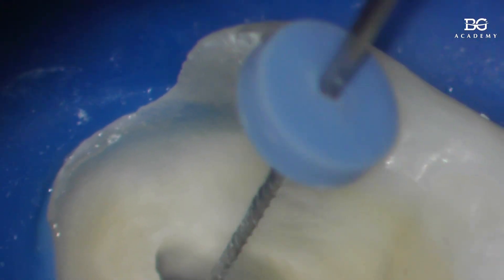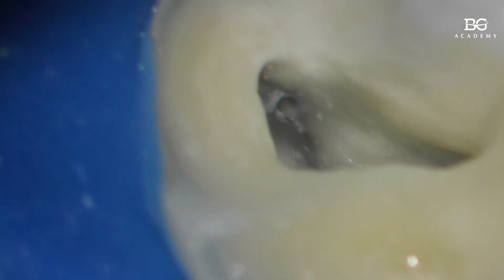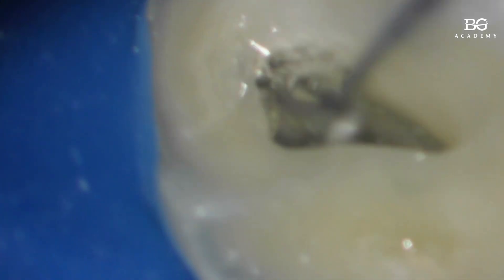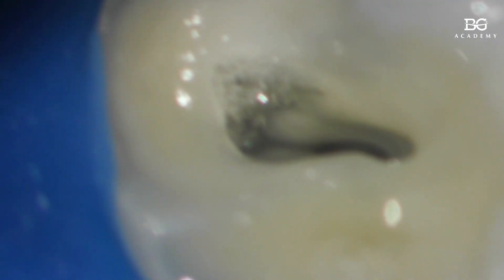After scraping, let's check together how much progress I've made. I still feel like I can go further — 17 millimeters! Can you believe it? Great. Let's rinse because there's a bunch of shavings in there. 17 millimeters — we were able, starting at just 14, to scrape a little bit. You should have a certain feeling when scraping: there should be some space ahead of the file tip. It's tight, but it's there — it's not like you've hit the wall and you're just stuck.